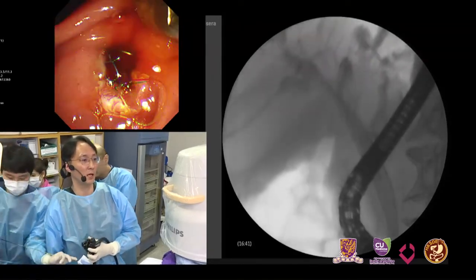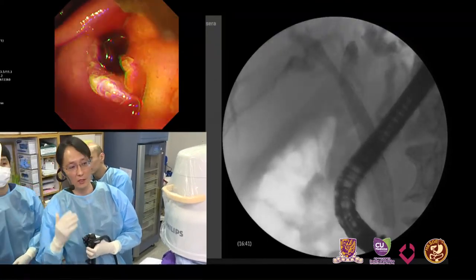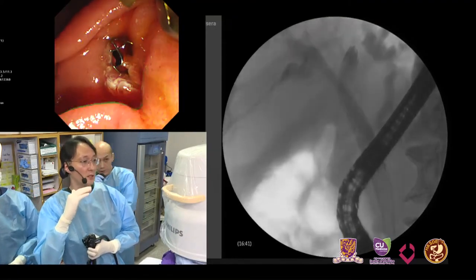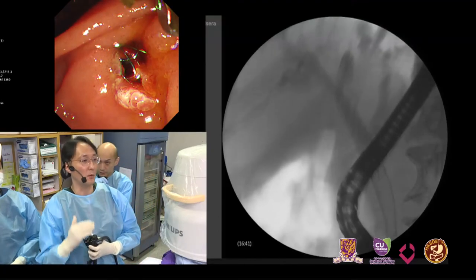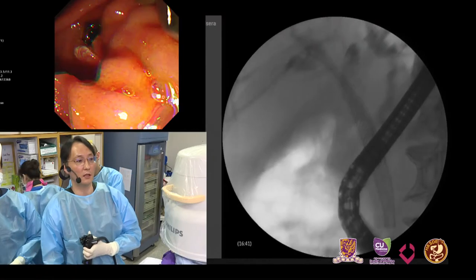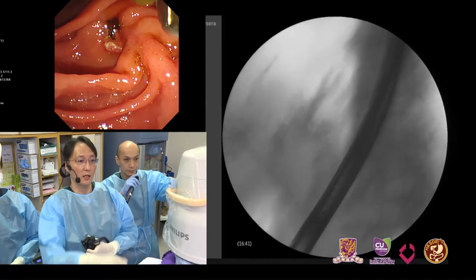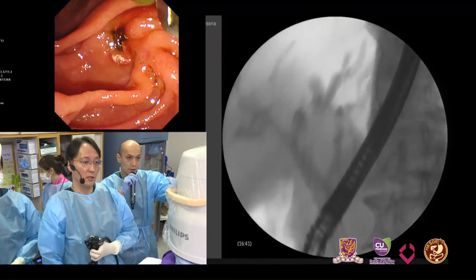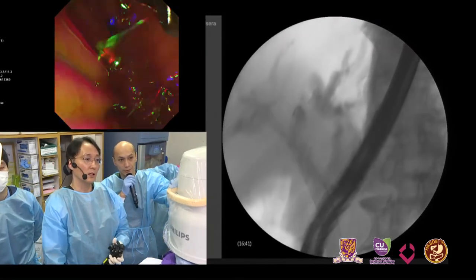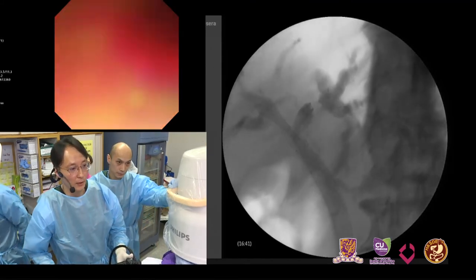Sometimes a stent inside the papilla is no problem, because some endoscopists want to better prevent duodenal biliary reflux. Maybe a stent above the papilla is sometimes preferred. Looks like I performed the EUS hepaticogastrostomy with the hilar SEMS, and there is a hepaticogastrostomy. It's good. Now the contrast is running off. So it's a complete drainage of all the systems. Very nice. Thank you very much.